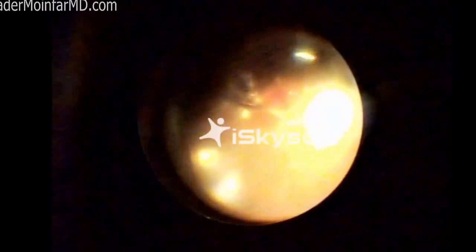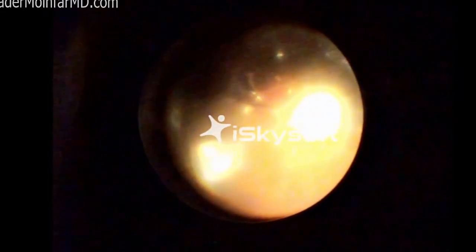So once this portion is completed, I typically exchange the fluid inside the eye with air, and that's what I'm about to do here. And again, the machine called the vitrector does all that stuff for us. We can either switch it on the foot pedal, or we can have our scrub nurse switch the settings on the machine, so that instead of fluid coming into the eye, air comes in, and you'll see an air bubble start to come in just a moment. So that's the air coming in, and while the air is coming in, I am simultaneously evacuating out the fluid. So I've used my foot pedal and switched it to just a vacuum mode and taking fluid out while the eye is filled with air. And so this kind of starts to wrap up the intraocular portion of the surgery.